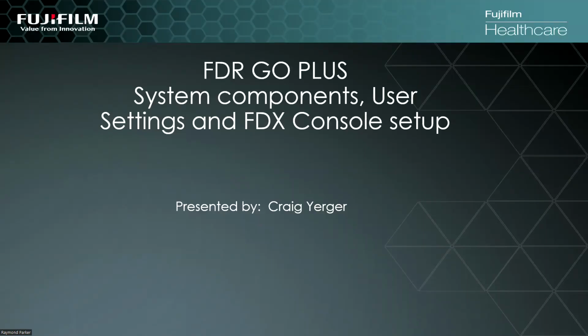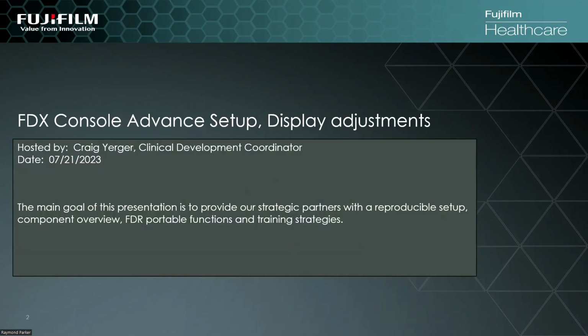Thank you for joining us on our FDR Go Plus presentation today. We're going to use a combination of camera angles and cameras to give you an overview of the FDR Go Plus. The goal for me was to present a series of topics that will provide your end users with a very strong FDR Go Plus setup, and provide you with the user settings for the portable, service utility, and user utility.